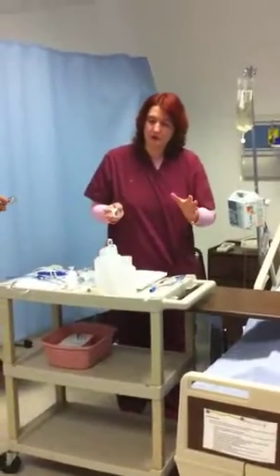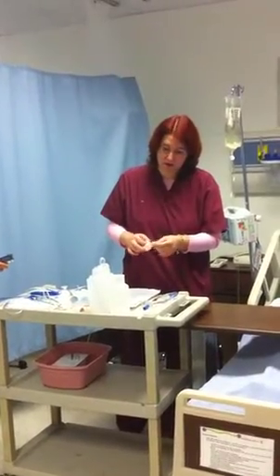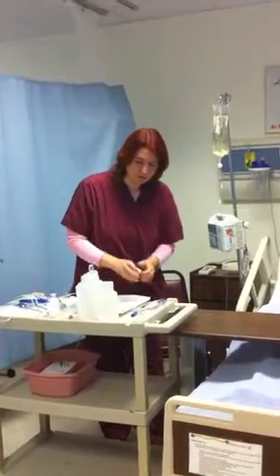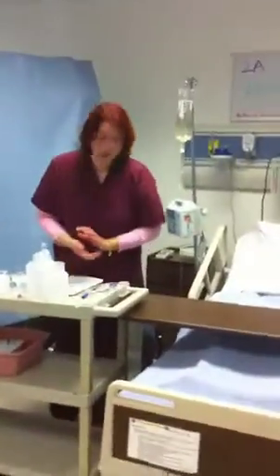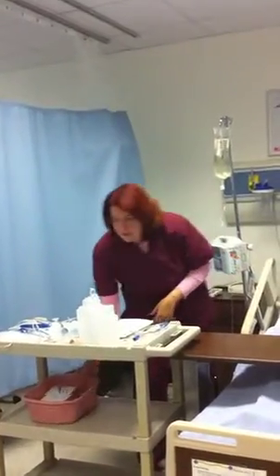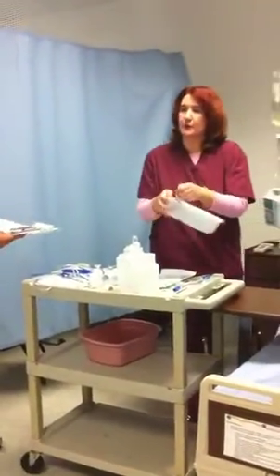Now, we are inserting an NG tube with minimum equipment, really, and you don't need to have a lot of items on your tray. And of course, you want to have a basin and a towel. Karen, would you mind, please? I need a towel and a basin. I have the basin here. Let me go get it. I got it. This is the irrigation tray, actually. Let me open it for you so you see.